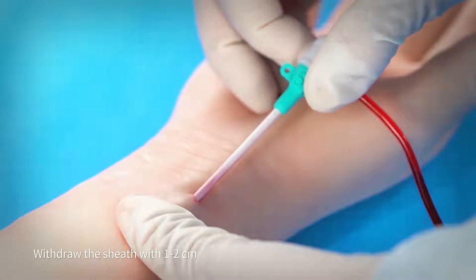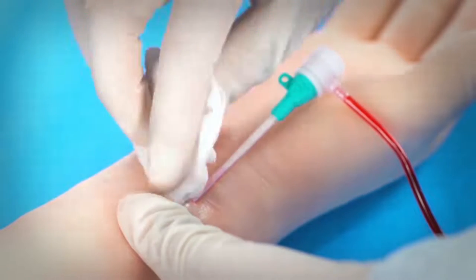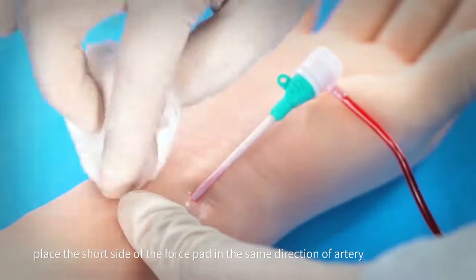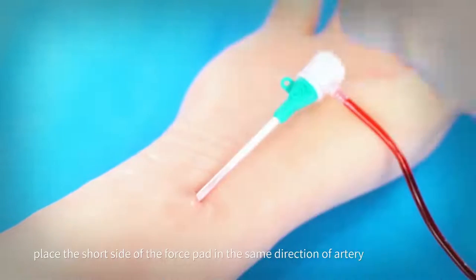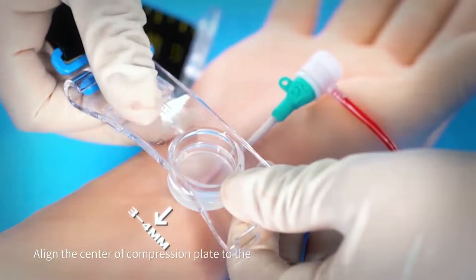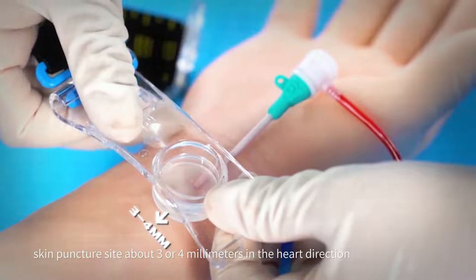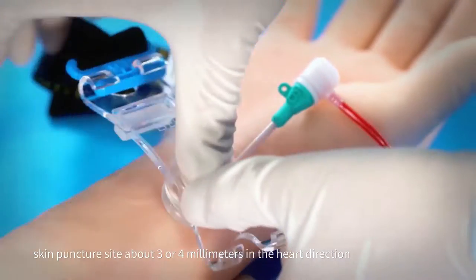Withdraw the sheath one to two centimeters. Place the short side of the force pad in the same direction as the artery. Align the center of the compression plate to the skin puncture site, about three or four millimeters in the heart direction.